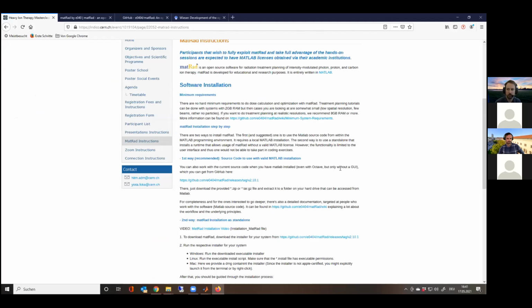I don't think we will need 1.5 hours to present the installation and executing the first script or doing the first things in the user interface. But we also want to use this time to discuss problems that might have occurred with people that have already installed it and saw that something didn't work.